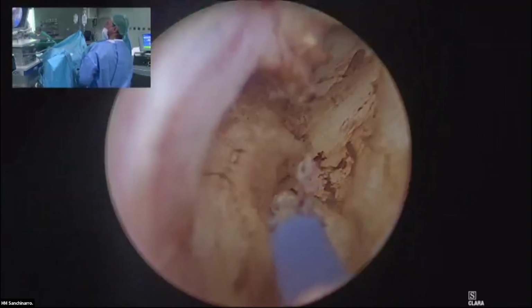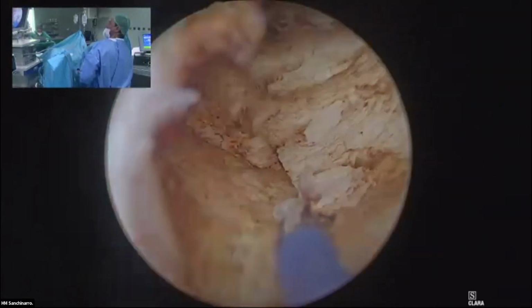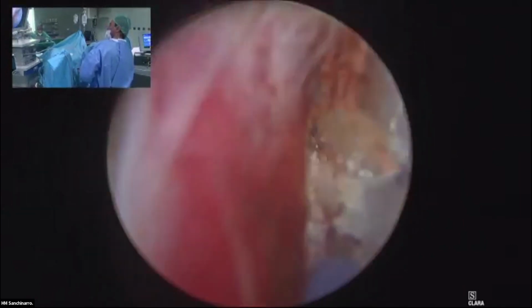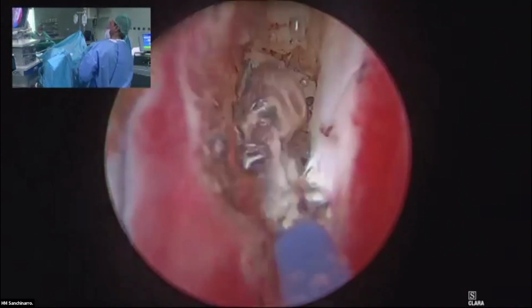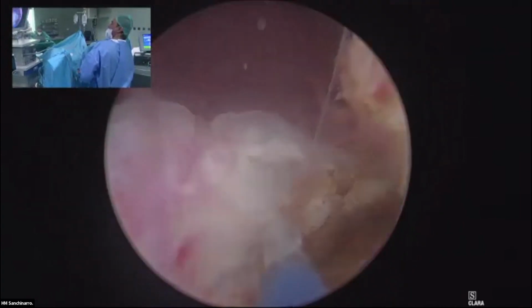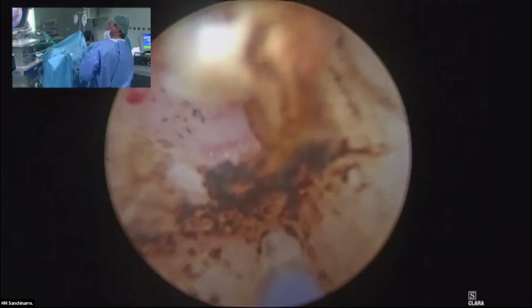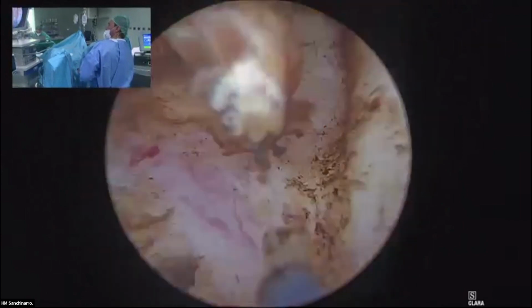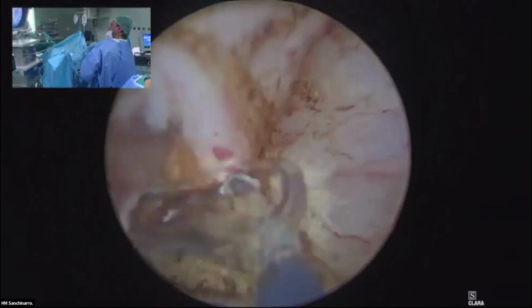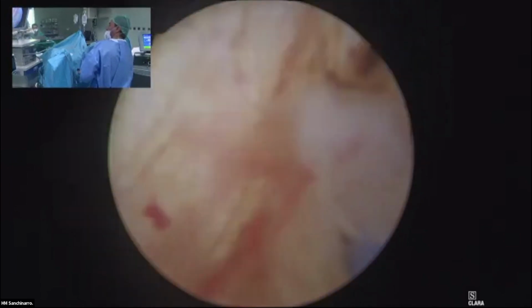With my setting, you see, it's not just a cutting effect, but it has a little bit of vaporizing. So I have more space in between the two lobes. So there's a little bit of surrounding vaporization. So I don't have a V-shaped incision, but a U-shaped incision. You see, it's just a little tongue of tissue. But now I'm going just downstairs. I do a little bit of traction, and I see that I'm in the correct plane, so I can go just underneath to enucleate this little part of the prostate, which is supposed to be my third lobe.